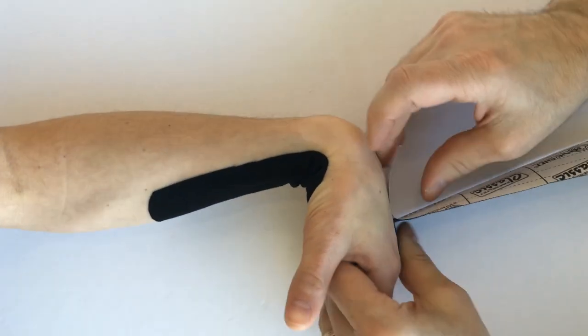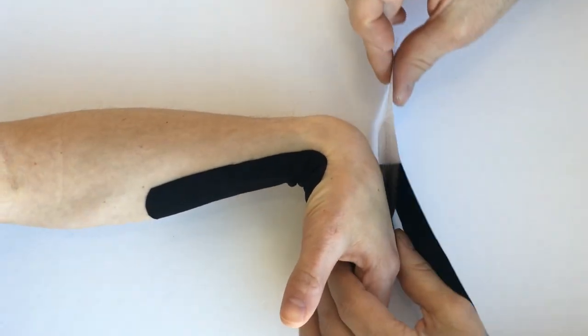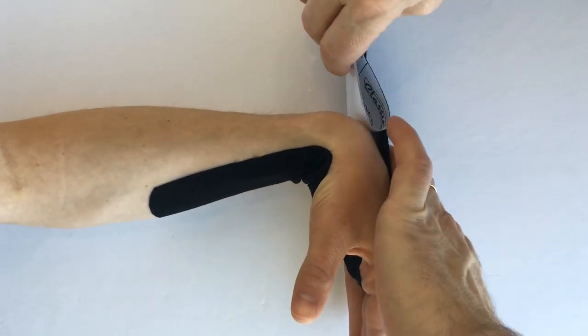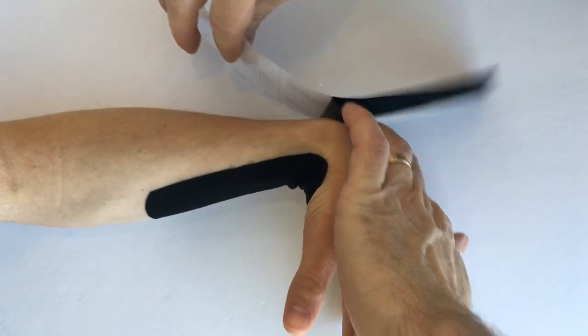Then we'll do the same thing on the other side and stretch the skin away from the tape as I'm applying it.